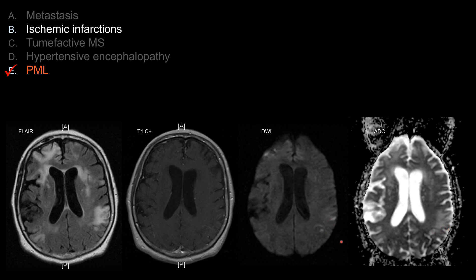But if you think about this being a chronic infarction with T2 shine-through with a bright ADC signal, for chronic infarction I would like to see more volume loss, which I don't see here. So B is not the best answer.